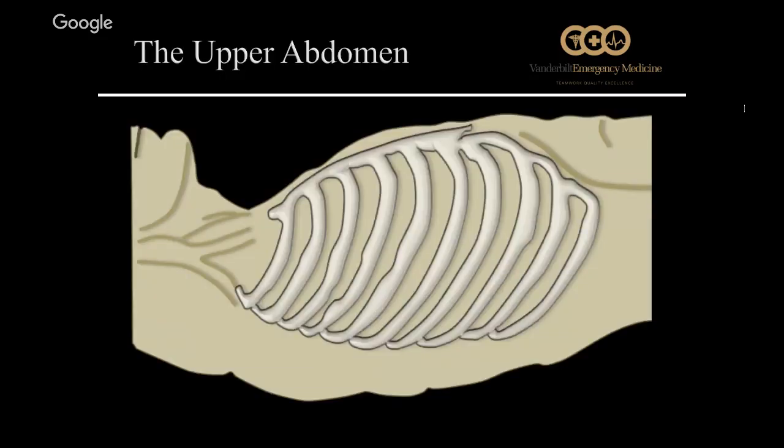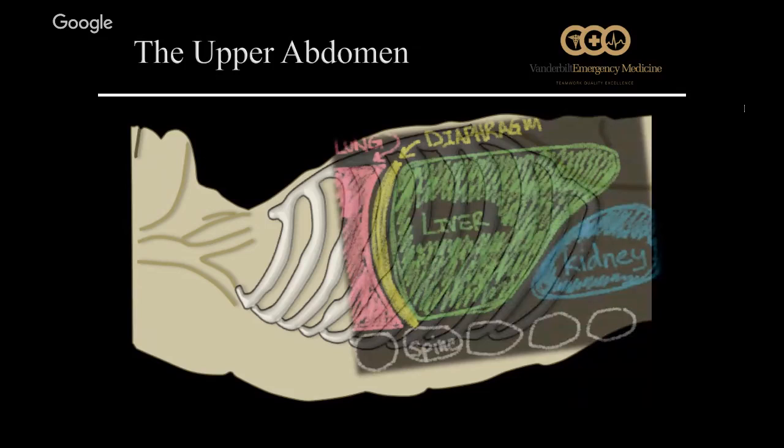Next slide. So here's where we're going to look. We're going to go to the right flank of the patient. We're typically going to use the curvilinear probe. Sometimes if the patient's really obese or has really narrow openings between their ribs, we may use the cardiac or phased array probe. But we're going to go on the right flank, probe marker up towards the head, and can click through to the next animation. And we're going to look directly over the liver. So if you think about where a boxer might punch to the kidney, that's where we're going to place our probe.